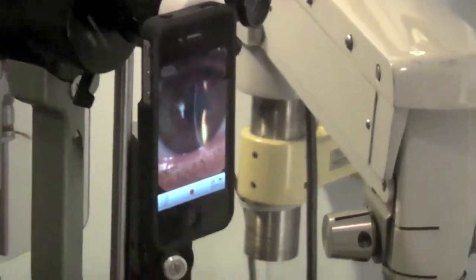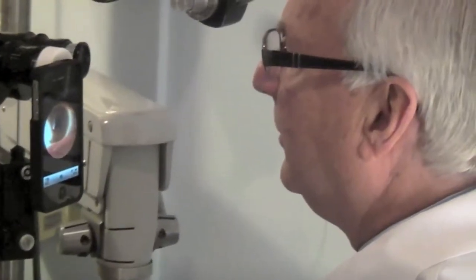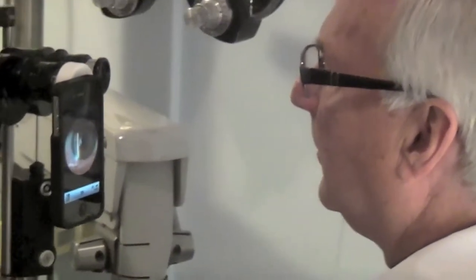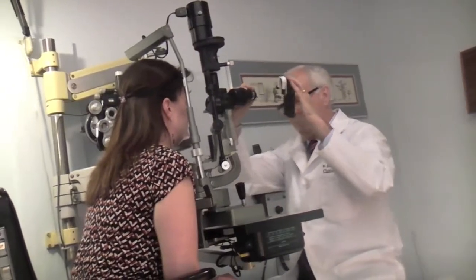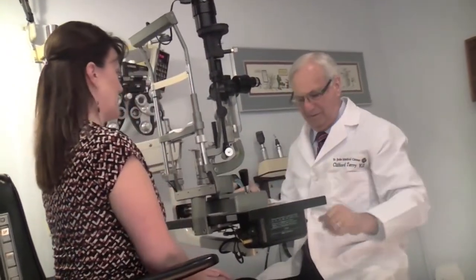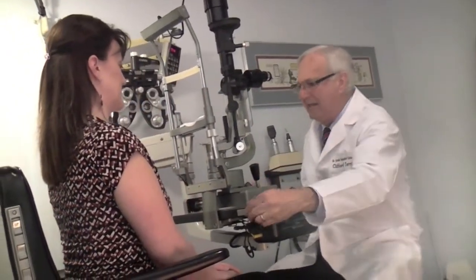When I get the right picture, I take it. I will recheck it to make sure that I cannot get a better picture. I then share it with the patient for increased rapport.